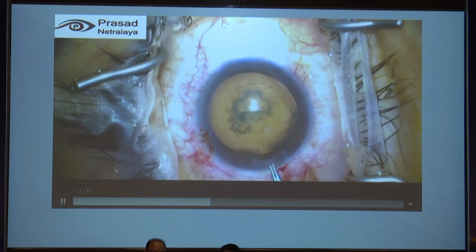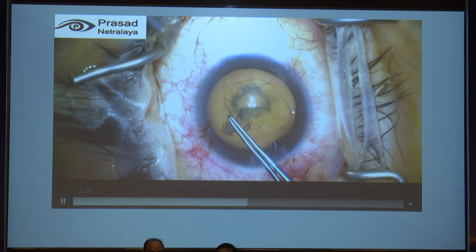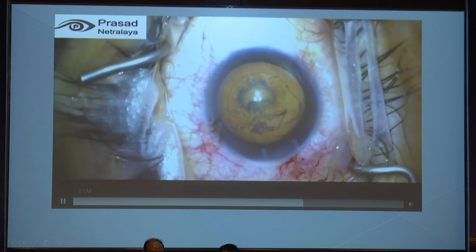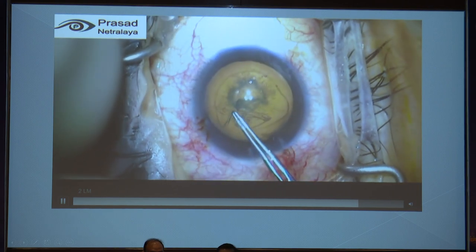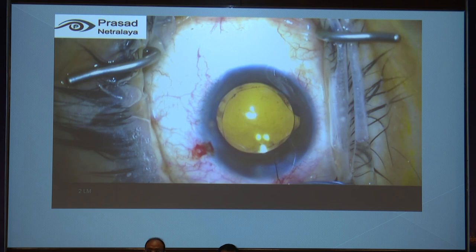So as to give a continuity there. This may not be ideal, but at least there is full continuity. If the patient or the surgeon are having a bad day, it's running off again. So now you see, you grab it and pull in the same direction you came from, not towards the center. That initiates a small rip which can be converted. So these are a few examples of how a rexis can be rescued.